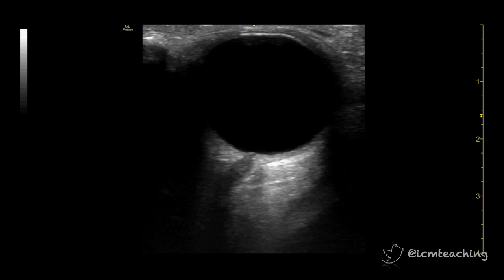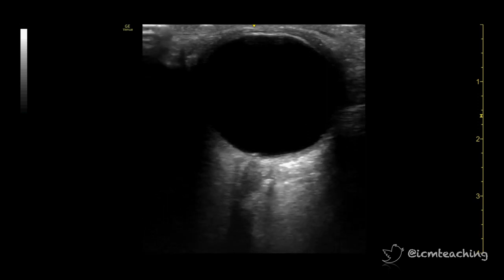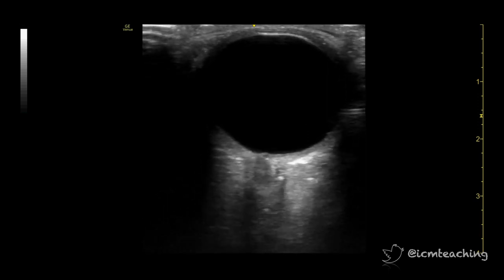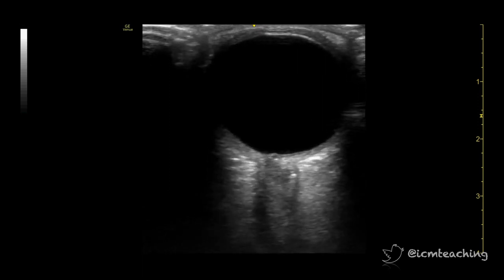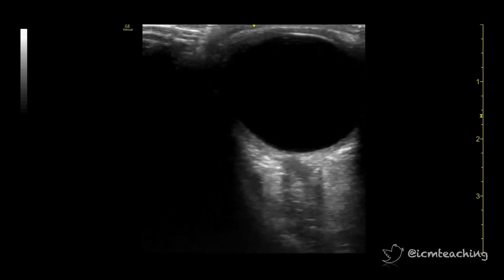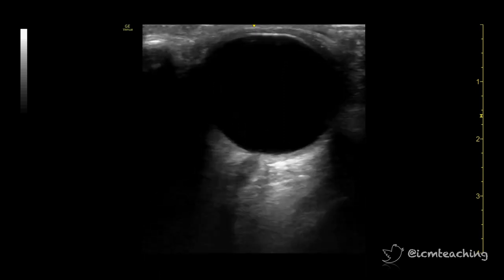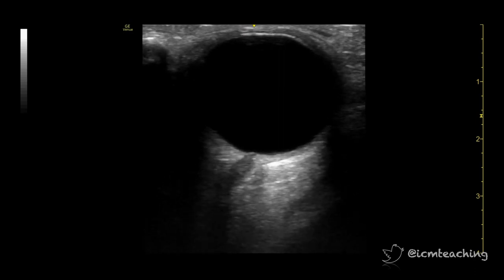This clip demonstrates how much the optic nerve can seem to curve from where it exits the globe and how this changes depending on the angle of inclination. Here I'm starting in a lateral position with the probe angled medially before gradually tilting my probe to a central and then medial position. Notice also that we can see a slight bulge from the optic disc, which I've tried to keep in view whilst moving the probe.